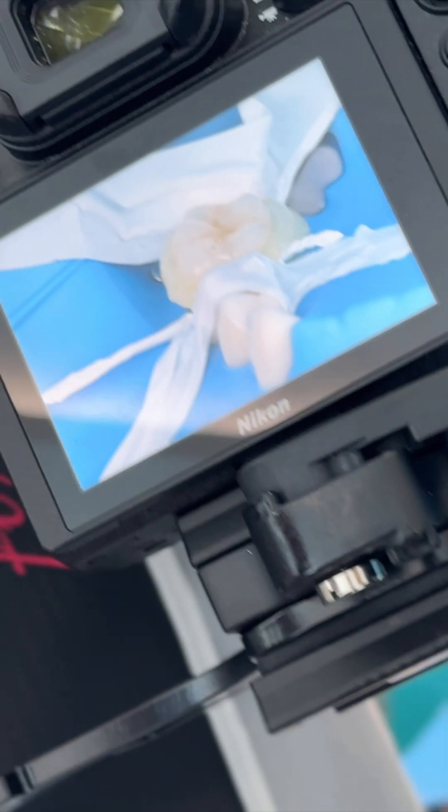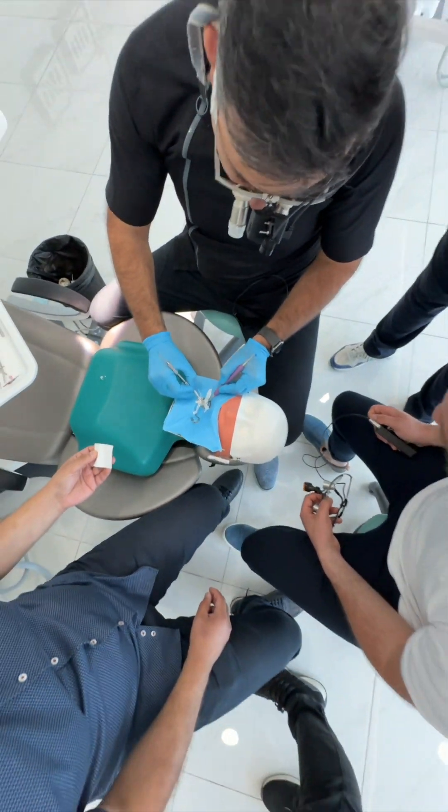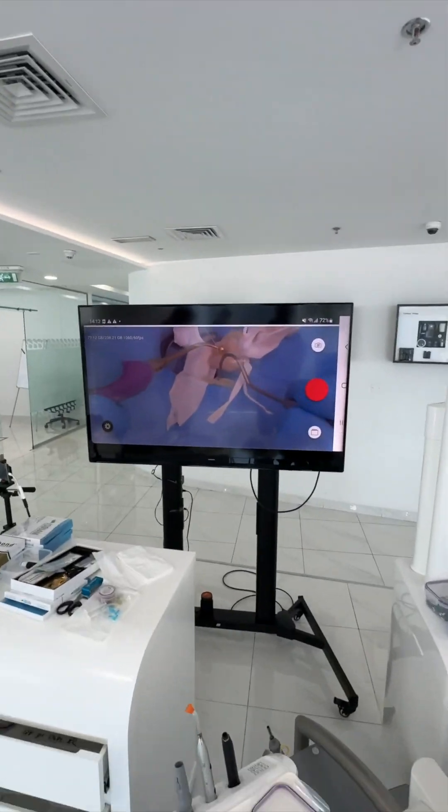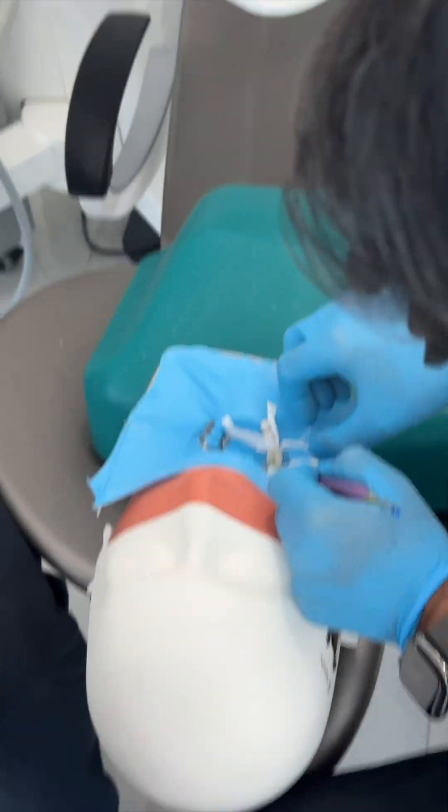Just because the patient cannot rotate his head. Coming in one piece is not only keeping your rubber dam clean — it also makes the after photos look nice. With the dual piece, then I just remove this.